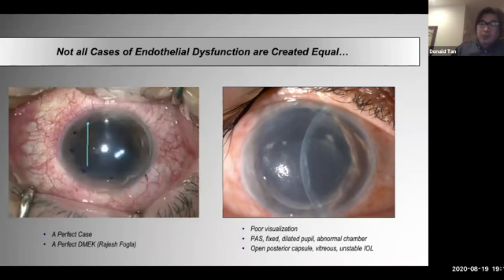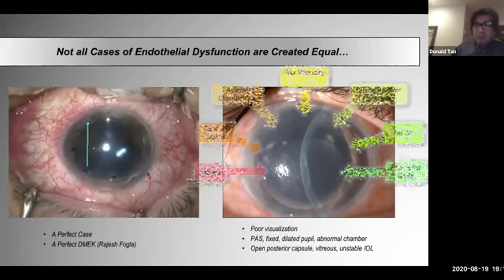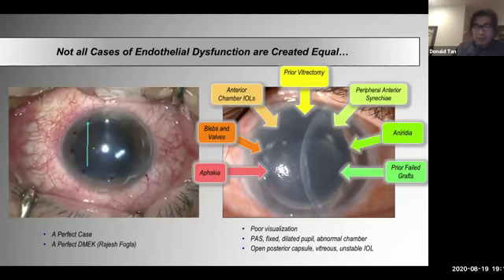And when you're first starting off on DMEK, these are the sort of relative contraindications which suggest that one should not try and do DMEK in these cases unless you're very skilled. So aphakia, if you have blebs or valves, ACIOLs, obviously, prior vitrectomy, peripheral anterior synechia, aniridia, and previous failed grafts. These are all major challenges.